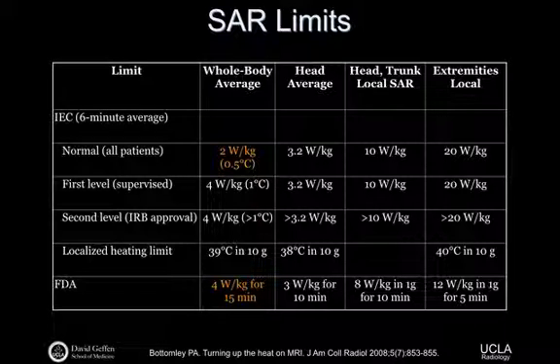And if I expose any of you to 4 watts per kilogram for 15 minutes, you will no doubt feel warm. If I do that for less than a minute, you'll say, I think I felt warmer. Might have been in my head. It's hard to tell. And then if we do that for 2 minutes, you'll say, no, I felt warmer. And then if we do that for 5 minutes, you'll want a new shirt. Okay, so anyway, that's where the limits lie.